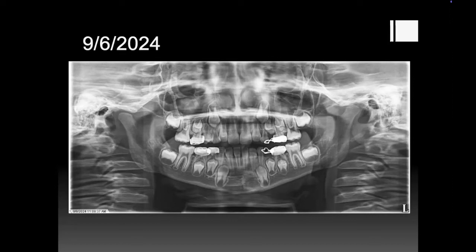And I tell the pedo residents all the time, just take panos every year and a half at the most. See what's going on. I don't care if they reimburse you for them or not. Get your reimbursement every 3 years, that's fine. But you need the information. It's not worth missing out on that information just for insurance reasons.